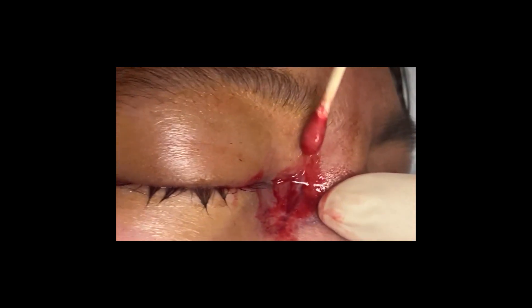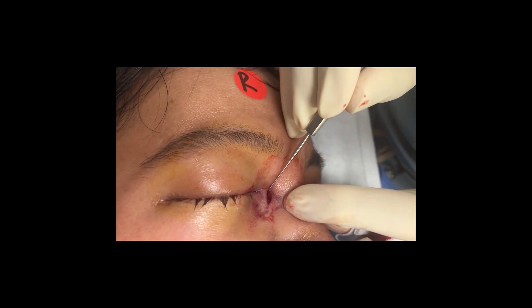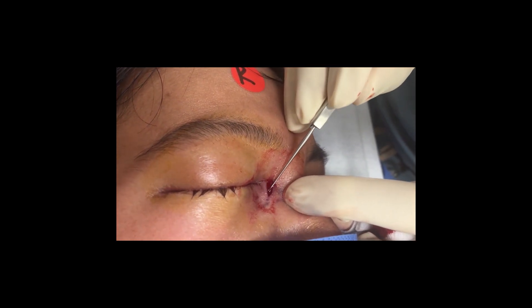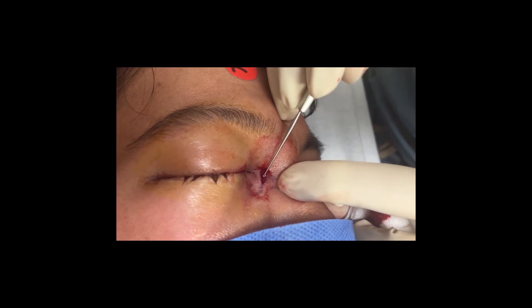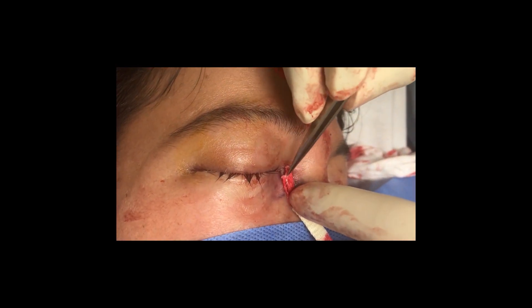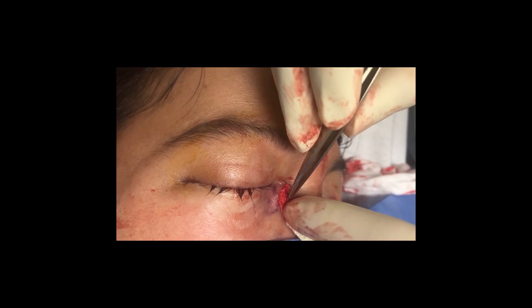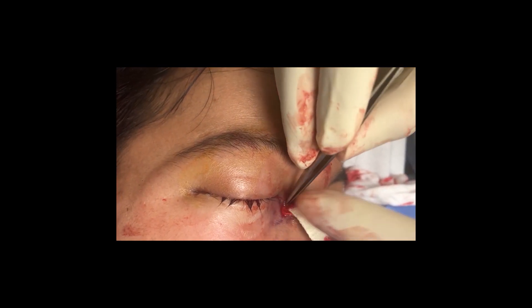A chalazion curette can then be used to disrupt any septations in the abscess to improve drainage. Iodoform gauze should then be used to pack the area, which can be removed in approximately two days.